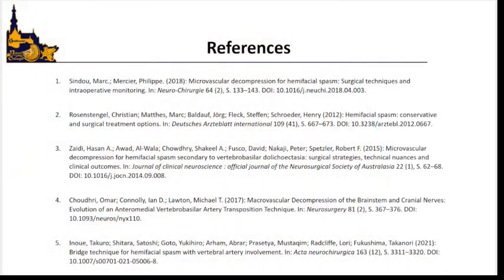In conclusion, the endoscope-assisted microvascular decompression in hemifacial spasm is an elegant procedure overcoming the limits of the purely microscopic view on the compression site, resulting in excellent outcome with a great impact on the patient's quality of life.